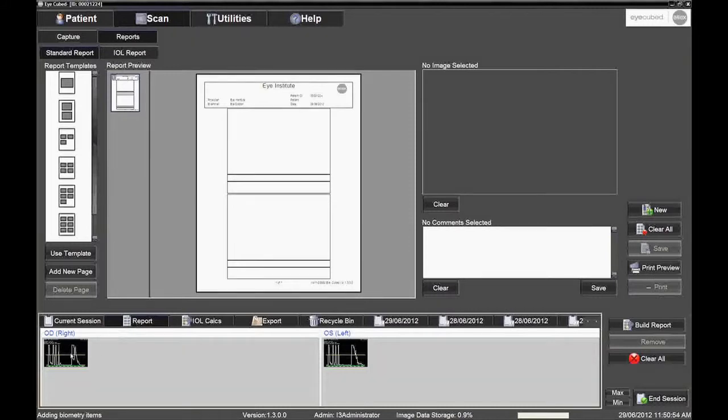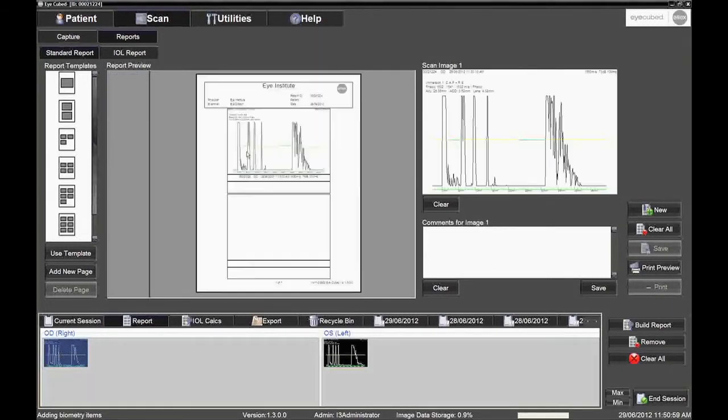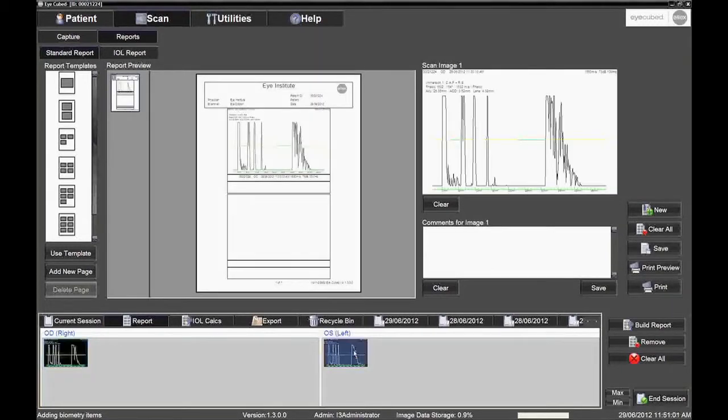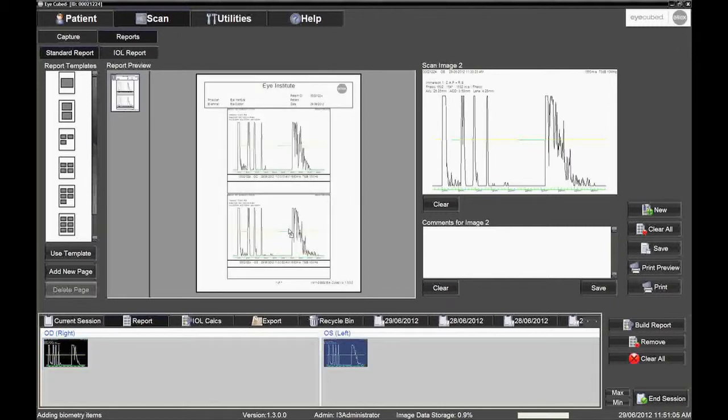For the right eye, drag and drop the image into the box on the top of Report. Repeat for the left eye by dragging the image into the bottom Report box. Save the report by clicking on the middle button on the far right side of the screen. The scan images can now be printed.